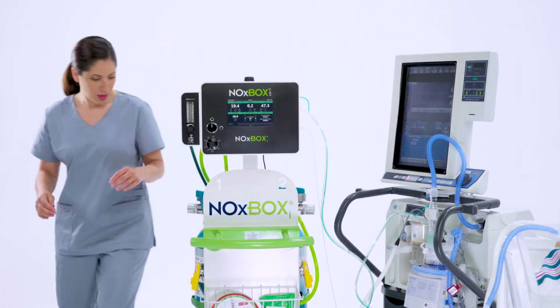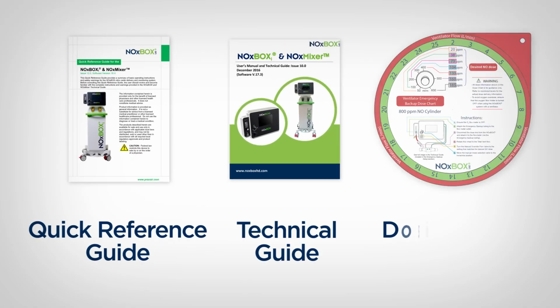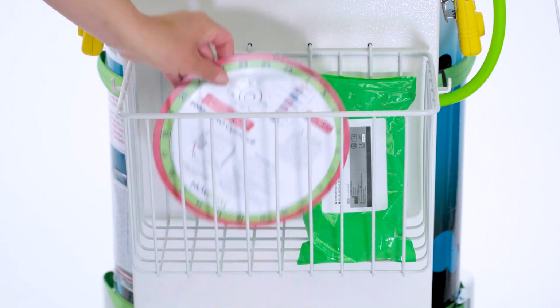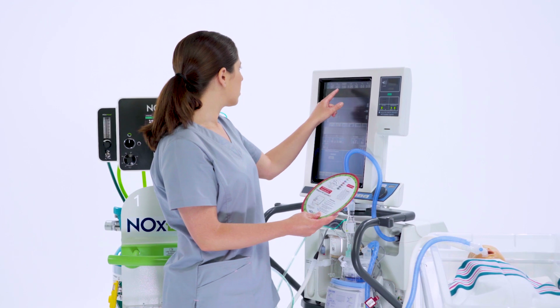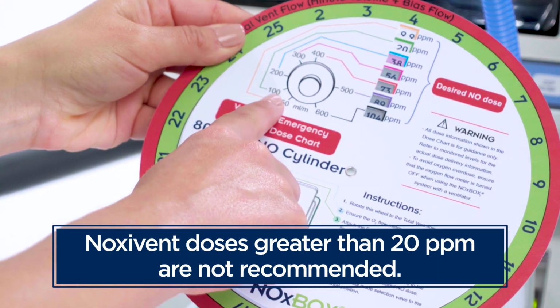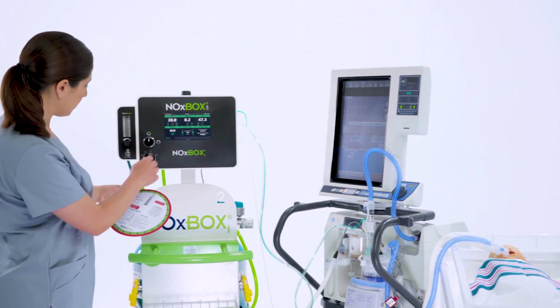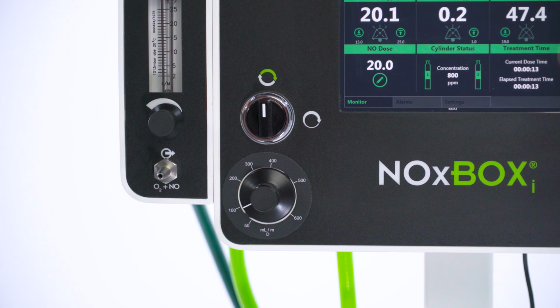To calculate the correct nitric oxide dose, refer to the printed dose charts found in the quick reference guide, the technical guide, or use the provided dosing wheel. Use the appropriate dose chart for the nitric oxide cylinder concentration. In this case, we are using 800 parts per million. Select the total ventilator flow rate and view the dose options. Set the nitric oxide flow control valve to the appropriate flow setting to achieve the required dose.